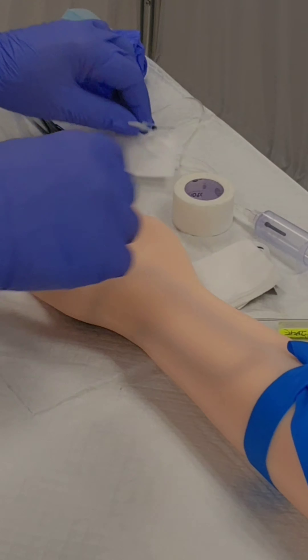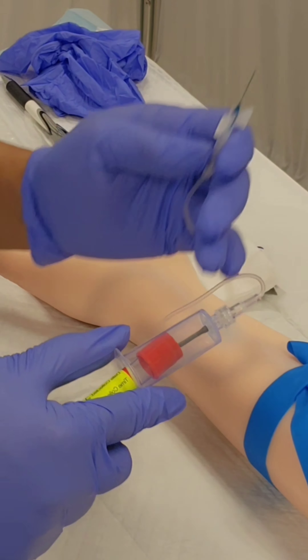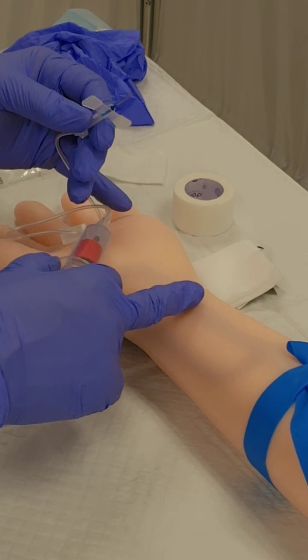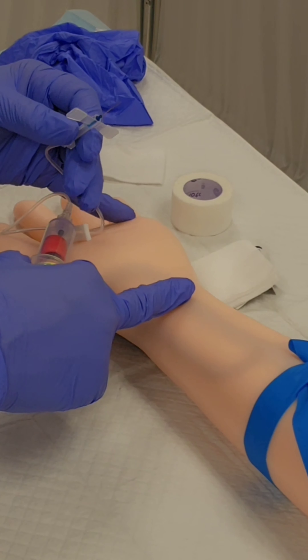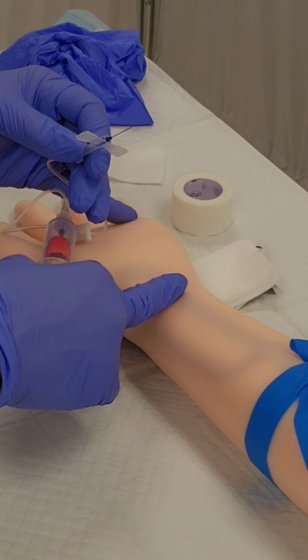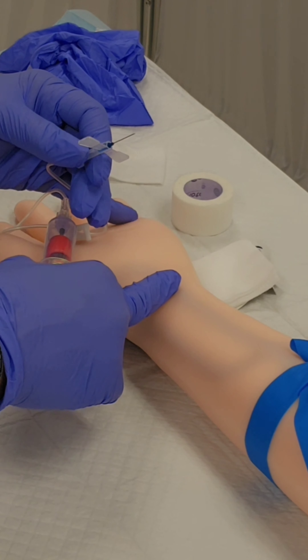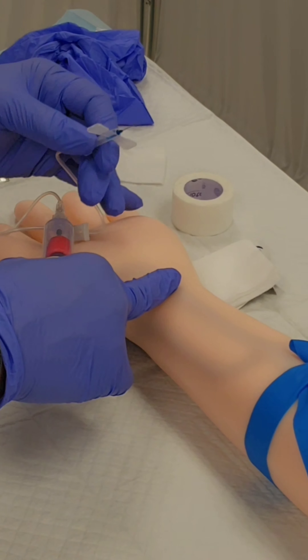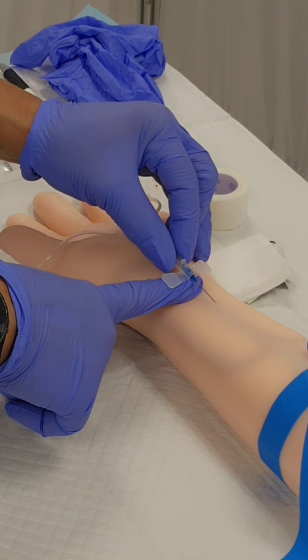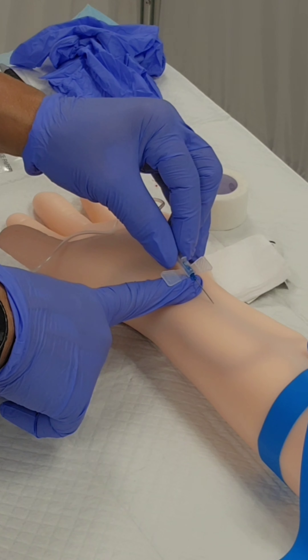Once I have the tourniquet in place, I'm going to pick up my vacutainer and tube. I'm going to place my tube in the vacutainer but I'm not going to pierce the seal yet. With one finger I'm going to anchor the vein by gently pulling down — I do not want that vein to roll once I pierce the needle. My goal is to make that first stick, because you don't want to keep poking the person. I'm going to go in at a five to fifteen degree angle with the bevel up and pierce the skin.